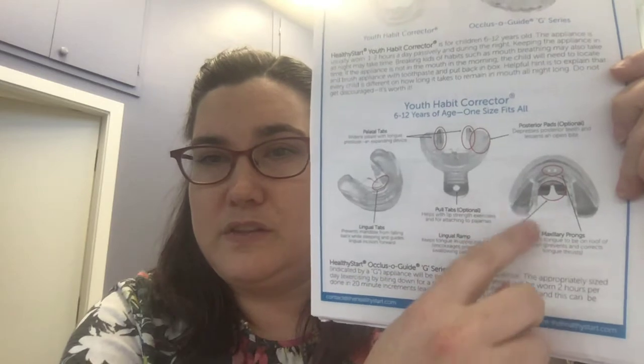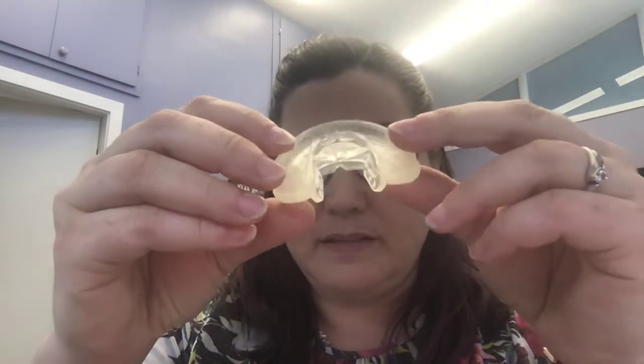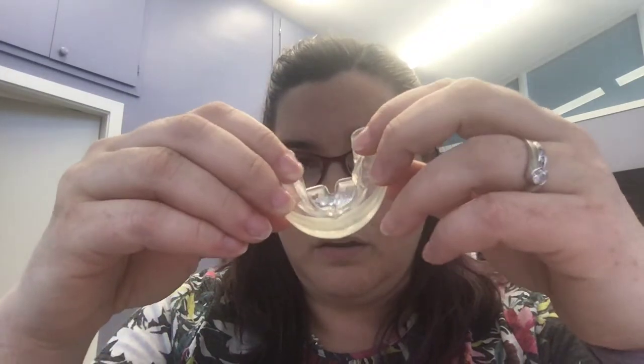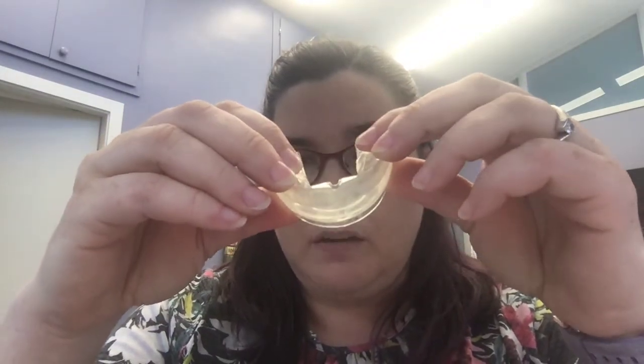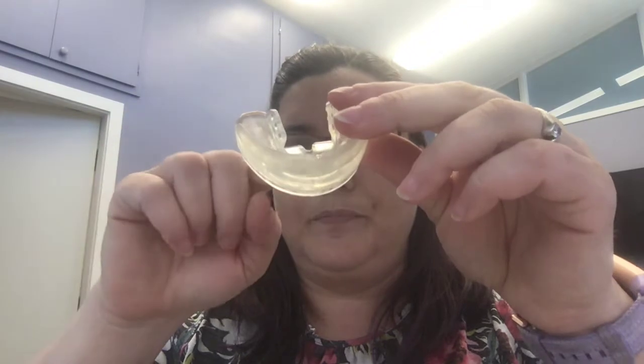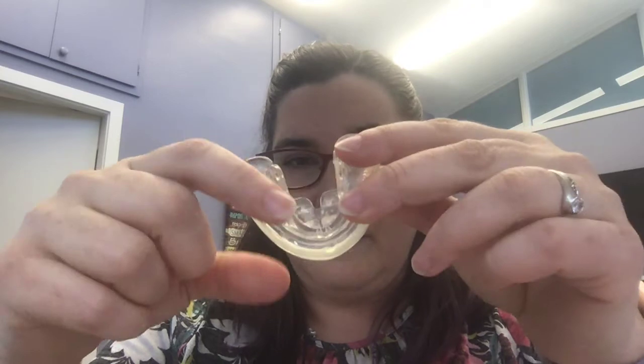Then there are the prongs, and that keeps the tongue from moving forward and thrusting. Now if you have a really significant tongue thrust, that can be a little bit hard to overcome, and that can be why the appliance is falling out at night. So showing those aspects on my appliance here — there are the tabs that the tongue pushes against naturally to widen the upper jaw, there is the shelf down there which keeps the lower jaw forward, and then there are the prongs inside.